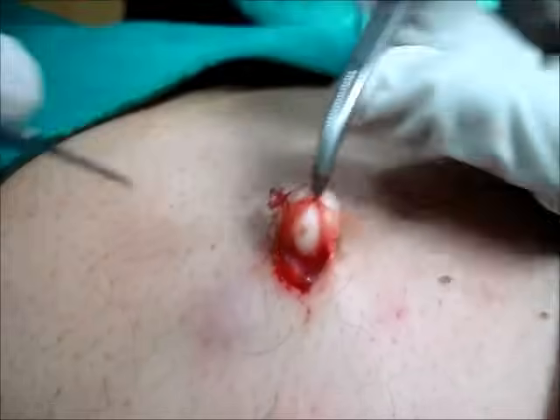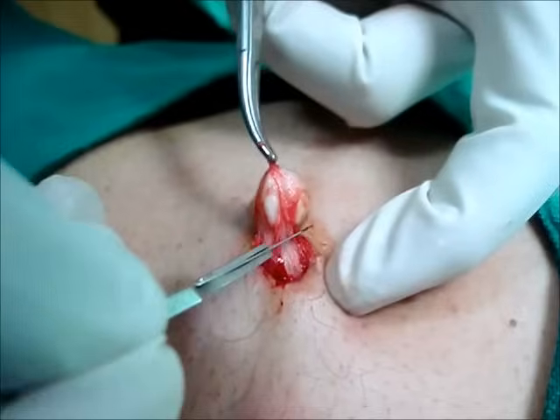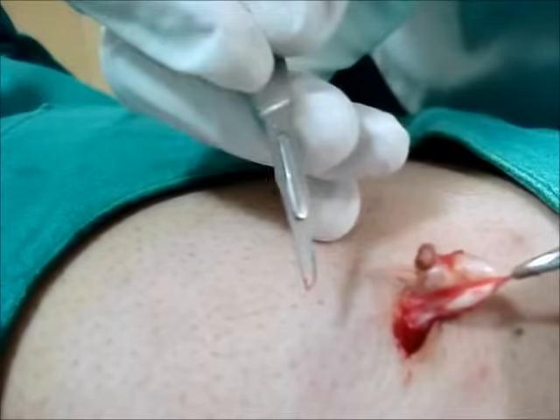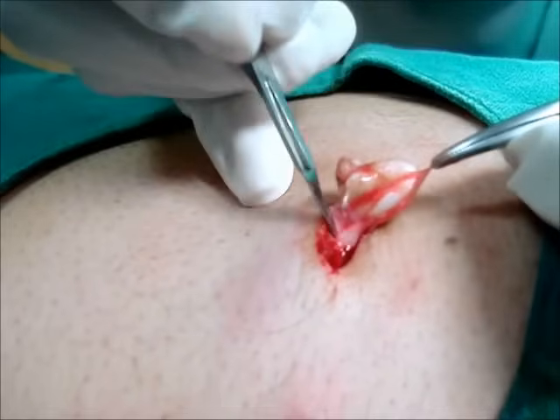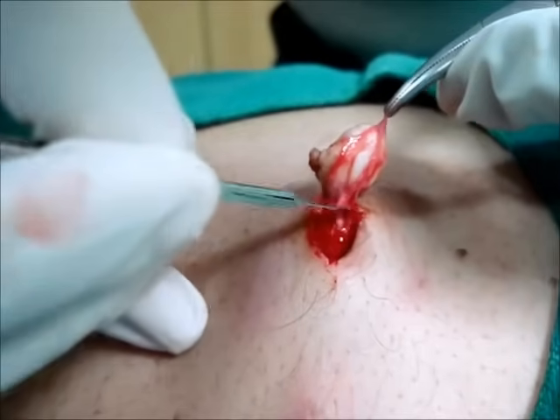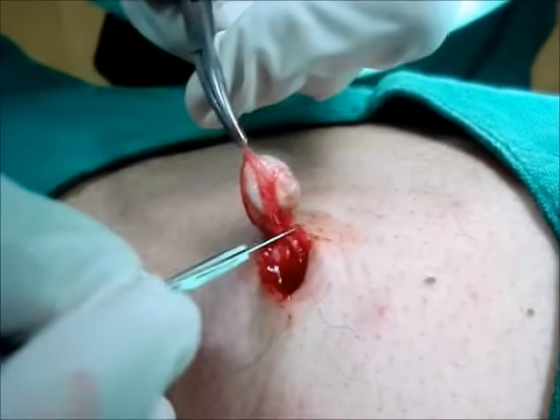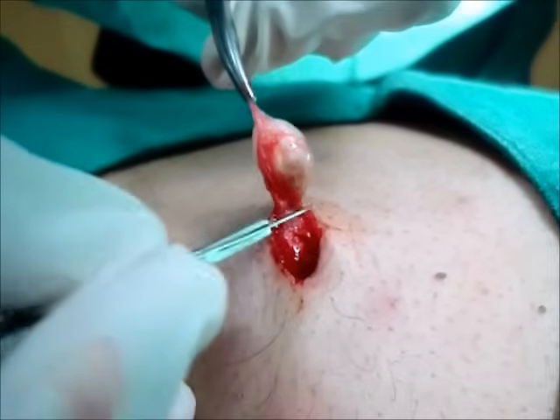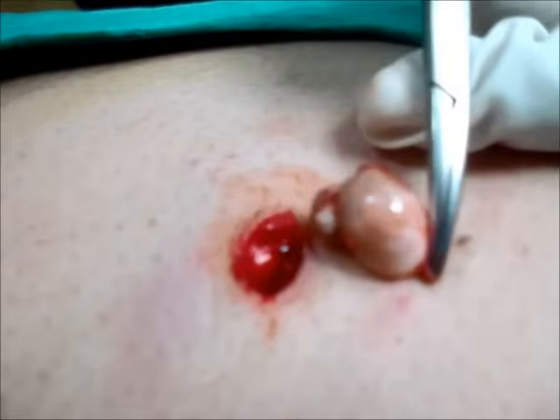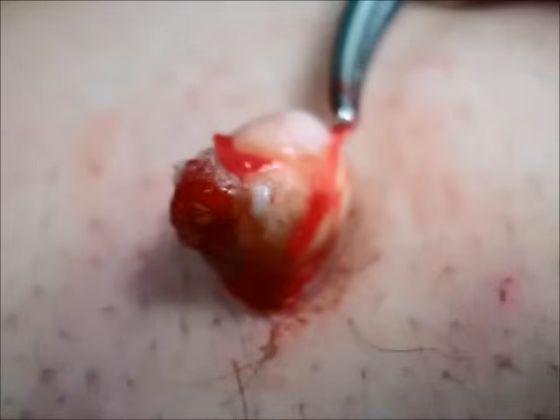Just divide the fibers at the bottom so that the cyst can be removed completely — it is almost out. This small cyst should be removed completely instead of just extracting the contents from it. And you can see, from that cavity, it is out.